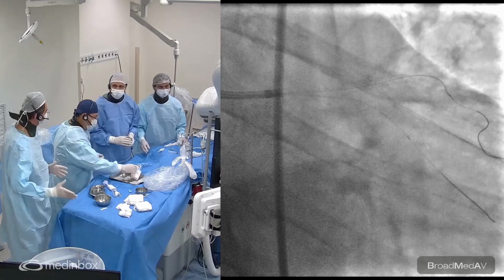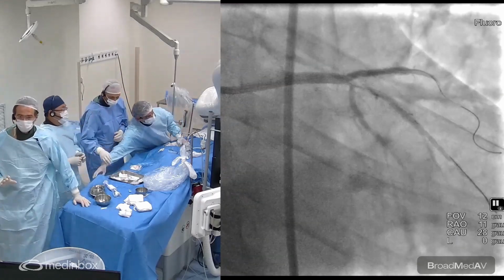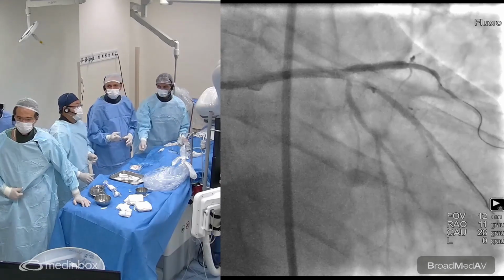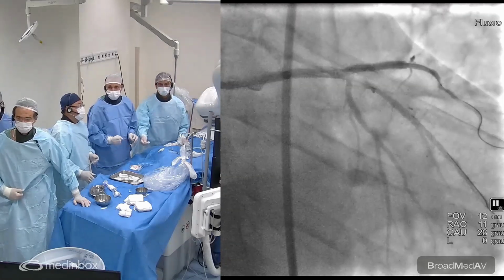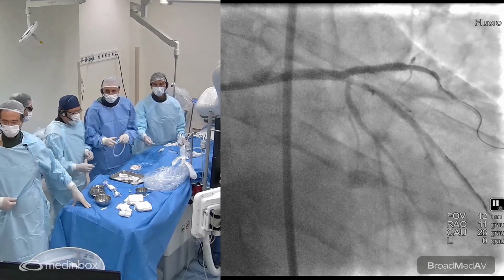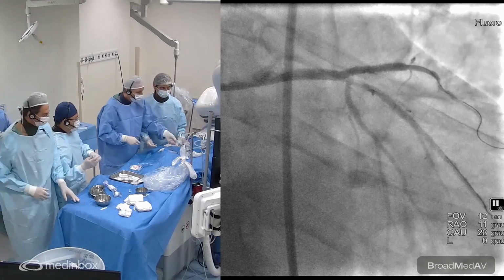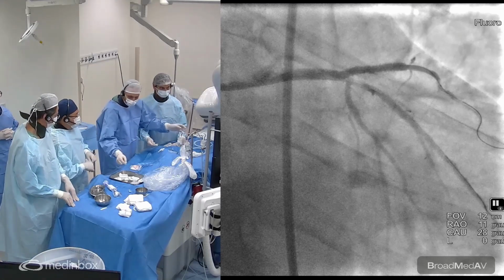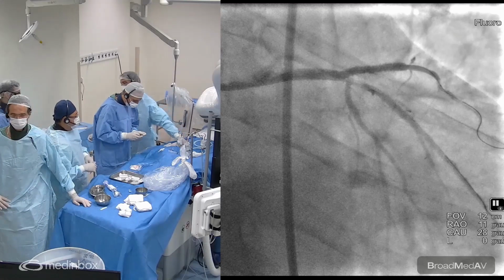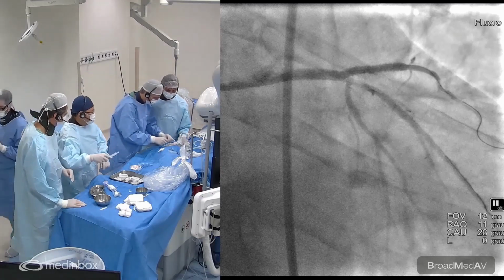First, we're going to work on the bifurcation. Yes. And later, in the mid portion of the stent. And then we can work this. Can you see the angle, how it looks after you deploy the stent? You see there's some pinching of the circumflex, and we expect that the POT will help us to better scaffold there and make it easier to reaccess. It's very important when you're dealing with the bifurcation, especially trifurcation, that you never lose the access and the wire into your side branch. Okay, perfect.